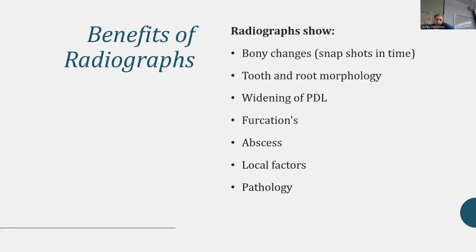But the benefit of radiographs is that they will show bony changes over time. If you take a consistent style of radiograph, you'll see the decrease in bone, or you'll see if a bone graft was successful. Periodontists and oral surgeons do guided tissue regeneration or bone grafts, and you can see that bone fill in.